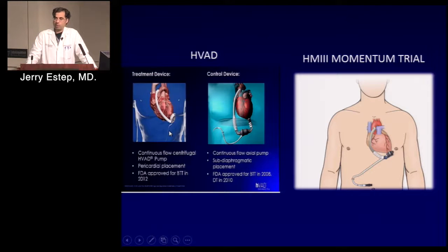So if I told you the tandem heart, you guys have visualized the tandem heart, is the tandem heart axial flow pump or centrifugal pump? Centrifugal, good. What about the Impella 2.5? Axial flow or centrifugal? Axial, microaxial physiology, right? It's coming parallel and leaving from LV. So whether it's the CP or Impella 5.0, those are axial flow, microaxial flow pumps compared to centrifugal pumps. And we won't get into the nuance of the degree of unloading related to these pumps. They do have different pressure-volume relationships in terms of head pressure, if you will.